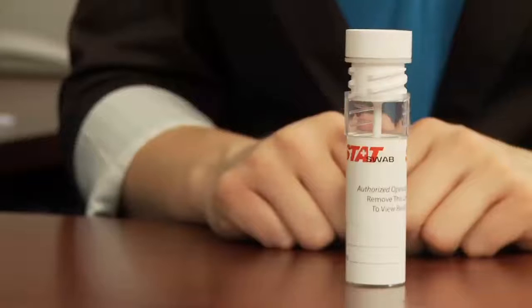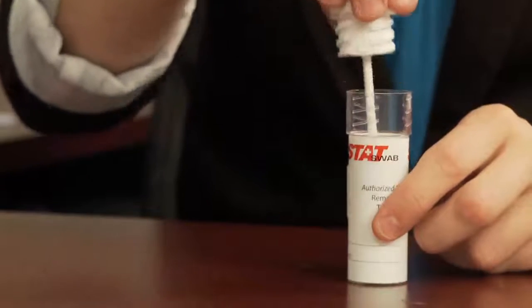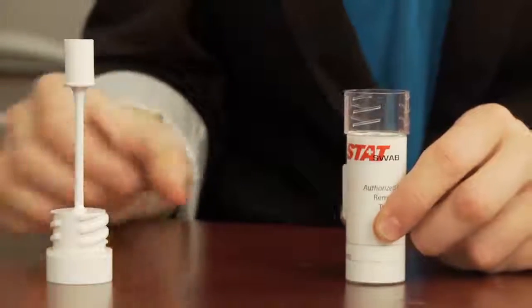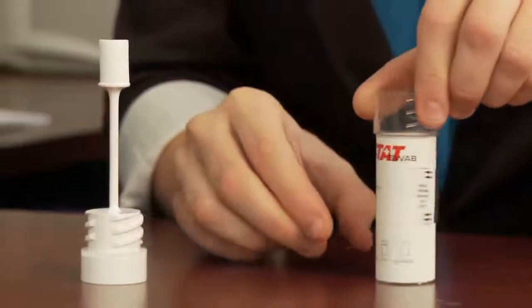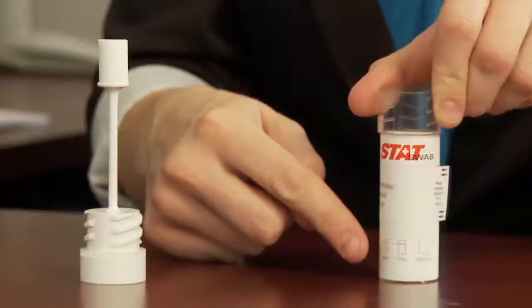Each StatSwab includes a collector cap and sponge, as well as a collection chamber with built-in test strips. On the label, you will notice a results key for quick reference. The label also has an area for the donor's ID number and the date.